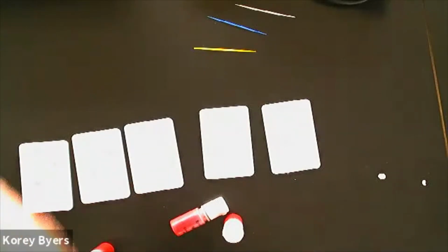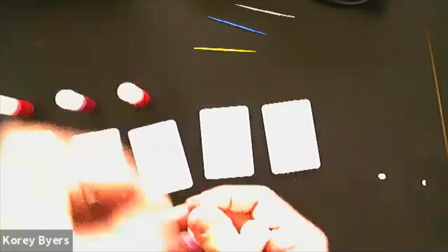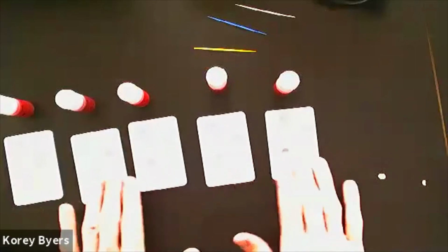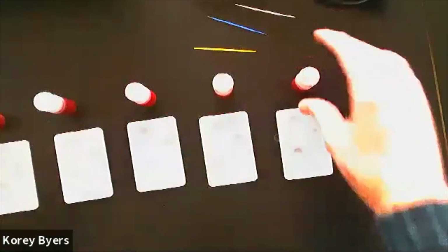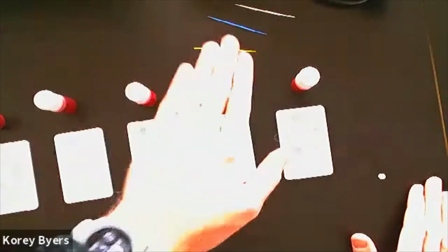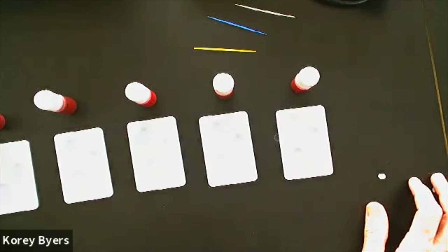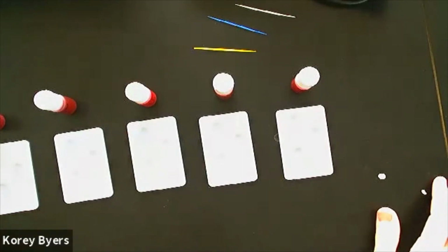June, Andrea, sample 1, sample 2, and sample 3. So that you don't get confused and accidentally get things mixed up, you should line your blood types up in front of a different tray. That lets you keep things straight. We're learning that part of good science is a good experimental design with nice quality data. So if you separate it like that, you won't get confused.